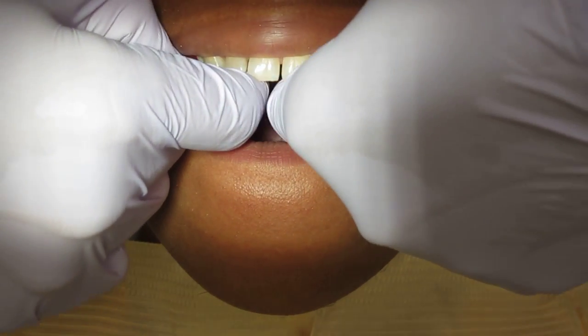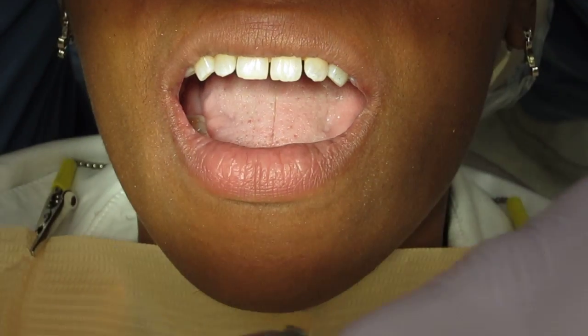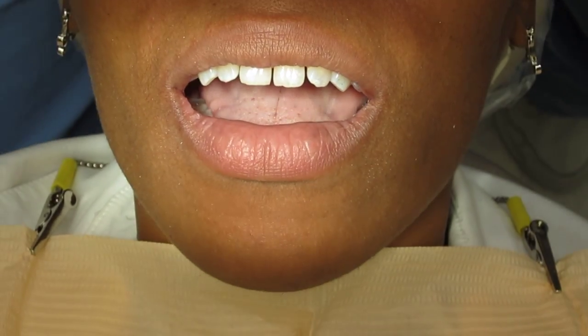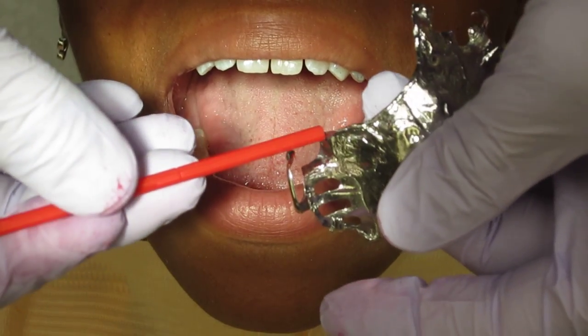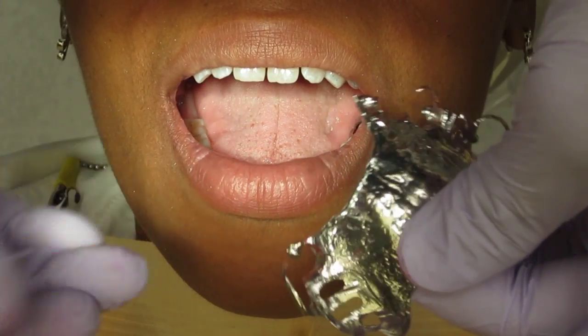And any binding. So take this out. What I'm looking for is on the inside here, just to make sure that we have even contact all the way around the guide planes and the plating.